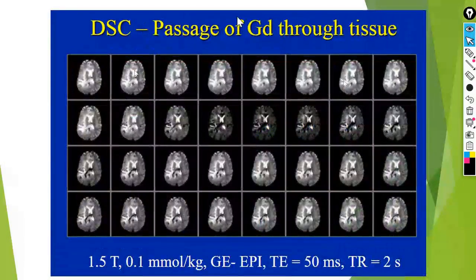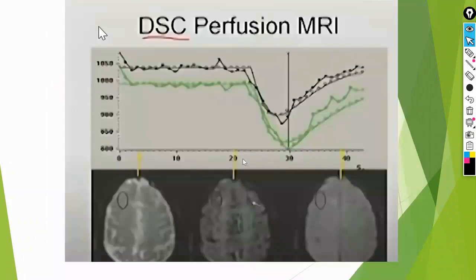This is the form known as dynamic contrast scan, which captures perfusion, allowing you to see the blood flow or observe the dye moving through the tissue. They always use a sequence called echo planar imaging, or echo planar sequence, in this context, which is considered a gradient sequence in this subject. It remains a very quick examination that takes multiple equal volumes and observes the flow of the dye within the organ or tissue you want to study.